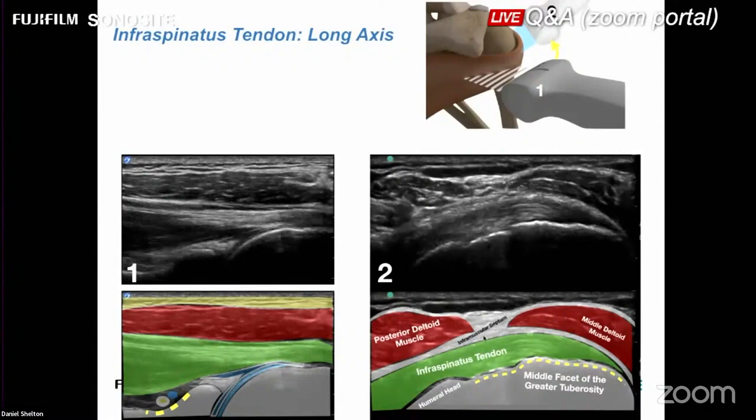You're going to end up with a slight refractile change in how the ultrasound beam is portrayed here. So it's less attenuated superficially, and it may cast a darker version of the image, versus here we have this really nice fluid-filled deltoid, which is also enhancing the underlying tendon relative to what happens underneath the deltoid septation.